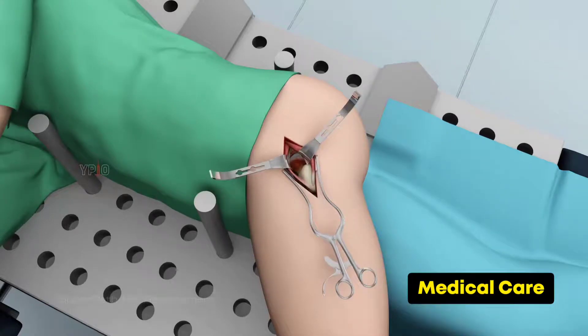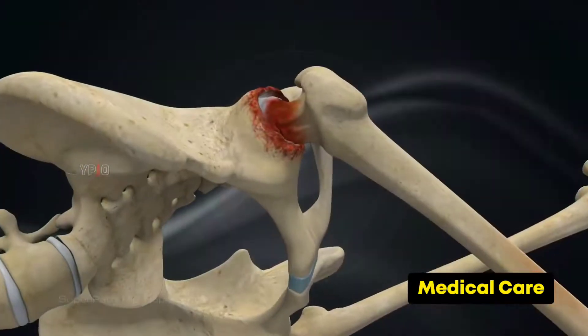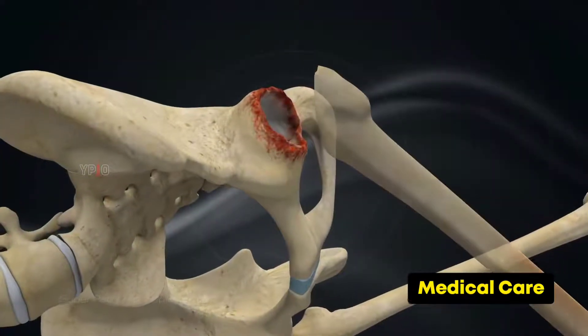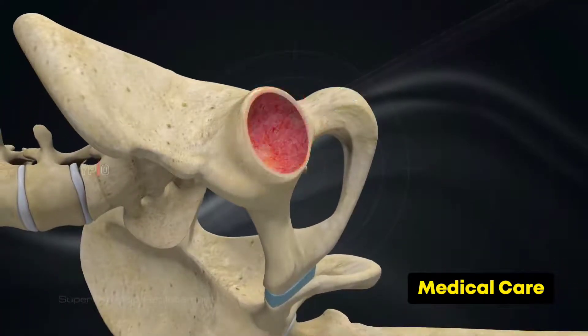The hip joint is accessed without cutting any soft tissues. Rarely, a tendon may need to be released for better access and is repaired at the end of the procedure. The femur is prepared to receive the femoral implant, and the damaged femoral head is cut and removed. The acetabular socket is cleaned out, removing any damaged cartilage.